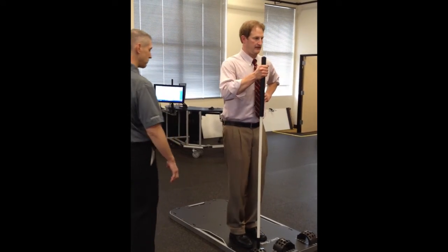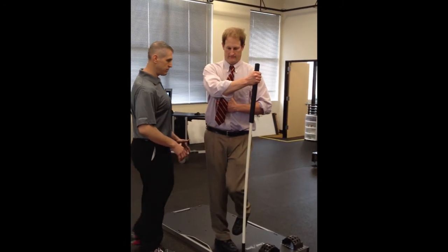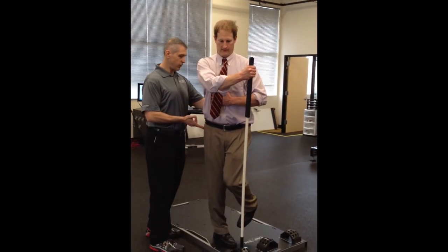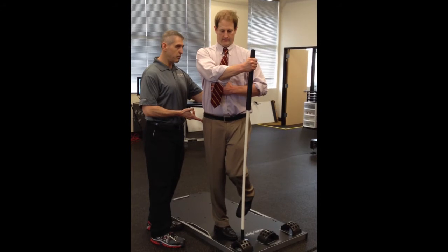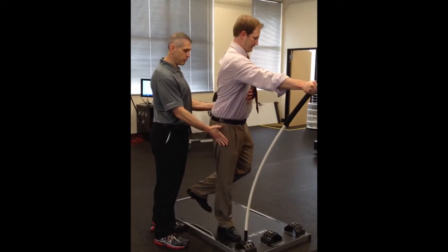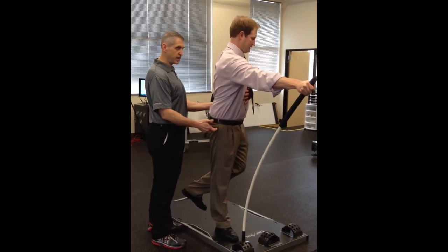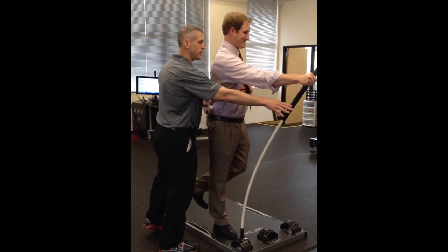And then coming with this rotating in — internal rotation, good. Now stay tall though, stay tall. Now push up, rotate, push. Pull that in, pull that in. Arch the foot, arch the foot, push that in. Now reach across the body.